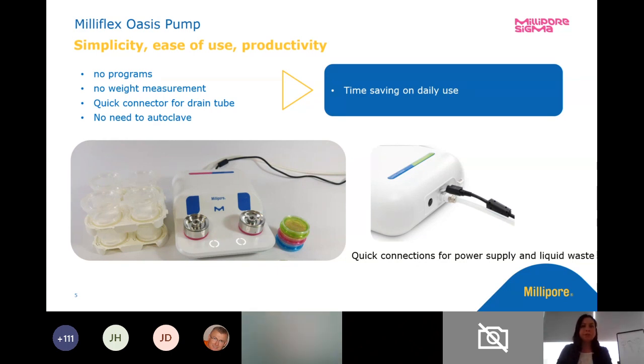Getting more into it — I talked about the low profile, how we can link three systems up and have a total of six filtration spaces. We also looked at ease of use: throughput, ease of use, productivity. We scaled back on the weight measurement, so we took that out of the current Milliflex Oasis. There are also quick connects, so I can just quick connect my drain tubing as well as my power source.